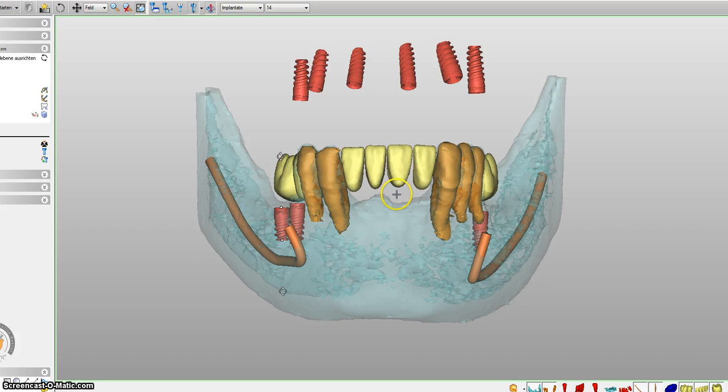of materials. One is the titanium crown. It's titanium fused with porcelain, or the other one is zirconium fused with porcelain. The only difference is in the aesthetics. The inner side of the titanium fused to porcelain is a metal. Titanium is gray, and the outside of the crown will be covered with porcelain, so it looks like your own teeth. The other, the zirconium crown, does not have a titanium base, so it's not gray, but it is white. Zirconium is white. And we have a white background, which is then again fused to porcelain.